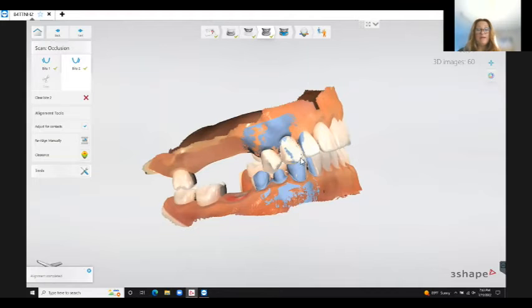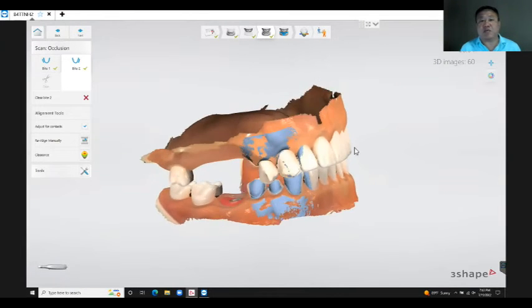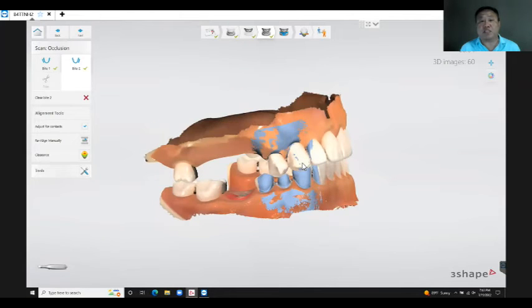I did hear that one come together, Bannister. Yes, there's a lag with the TeamViewer on and connected to the Zoom. So the specific motion, I'll try to show it to you. Basically I'm going to place my scanner on the same area where I placed it and took the bite, this area where the blue is.